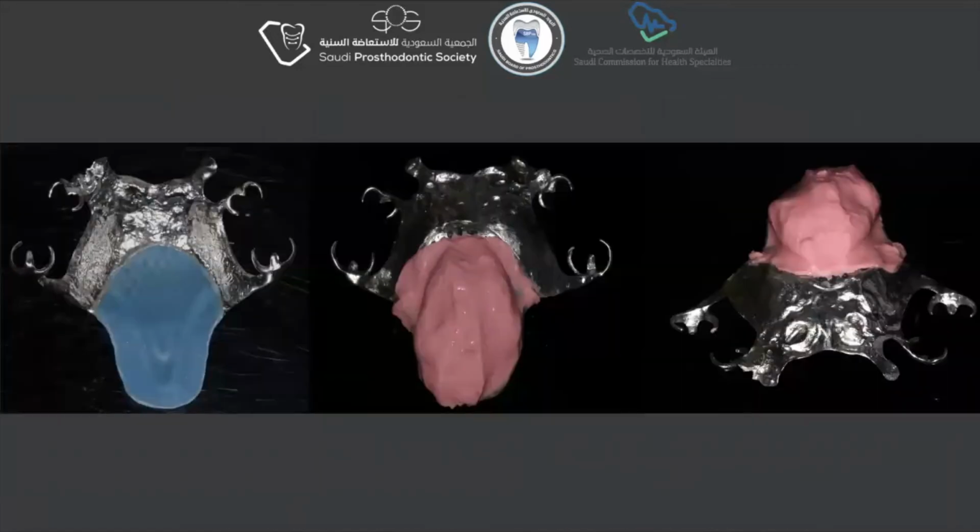After that, the technique that I prefer to use for such a patient is that we can add a tray sheet for the defect area and take the impression with irreversible hydrocolloid or any impression material that the clinician prefers, only for the defect area, without any pickup impression.